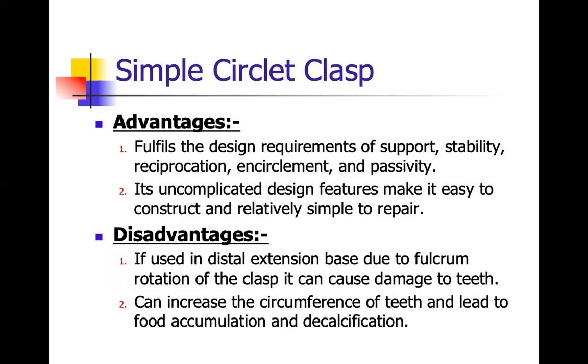The advantages of the simple circlet clasp are that it fulfills all basic design requirements of retention, support, stability, reciprocation, encirclement, and passivity.